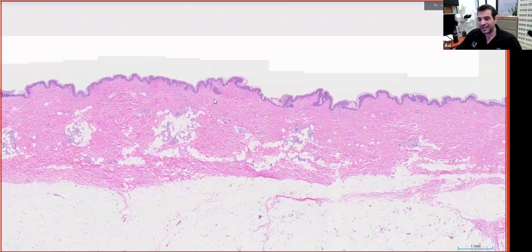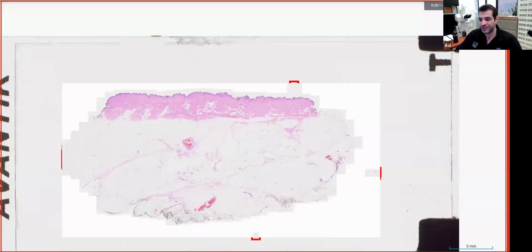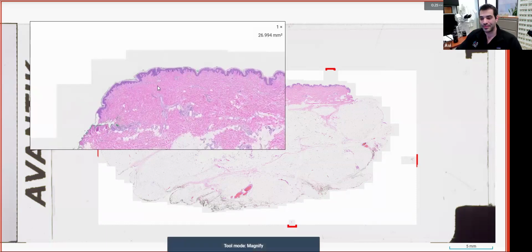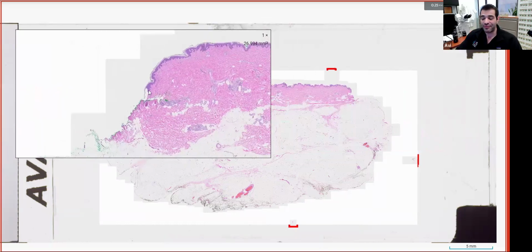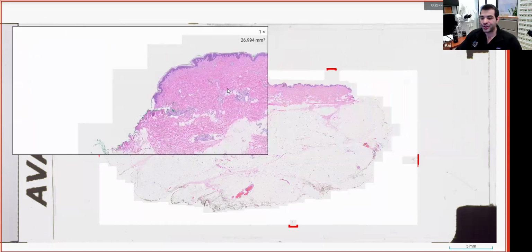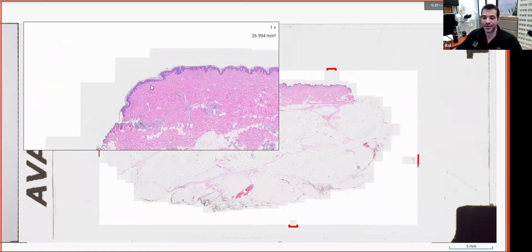The best way of clickless panning for cases like this that I found is to use a magnifying function. A magnifying function is like a scan slide within a scan slide. You can think of slideception. I'm going to show you what it looks like right now. Boom, there it is. So this is your magnifying glass, and you can tailor your magnifying glass to whatever dimensions you want to take up on a slide. And you can pan just with the mouse, just by moving it. You don't have to do anything beyond that.